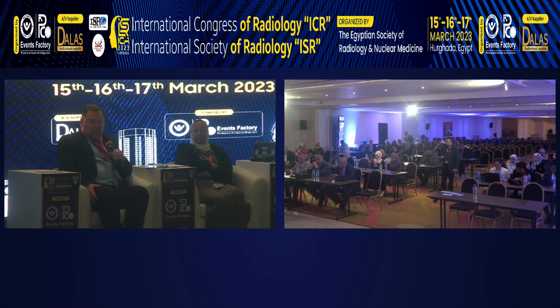So if you have PET-MR, it's nice. But if you don't have it, it doesn't mean that you have worse diagnostics. It's definitely not true. If you have beautiful 3 Tesla machines with nice gradients, and a new generation of PET-CTs with good detectors, you are state of the art. So it's nice to have, but it's not a condition for high-end diagnostics. That's approximately how I look at it. Thank you.